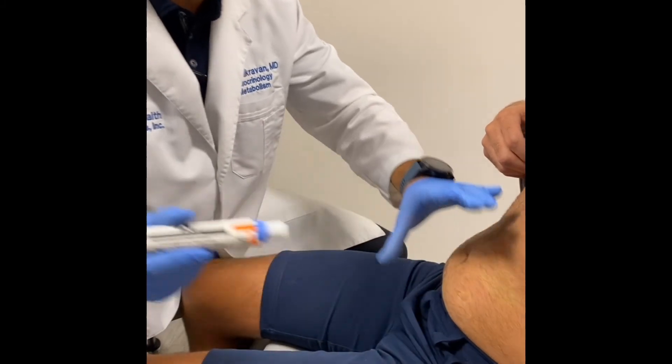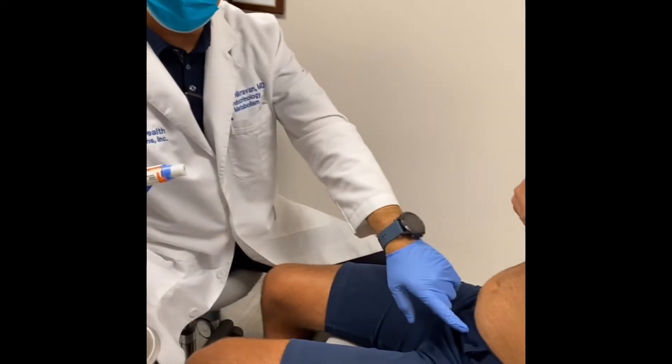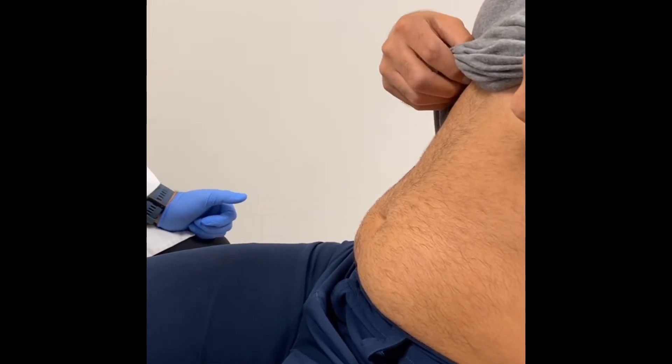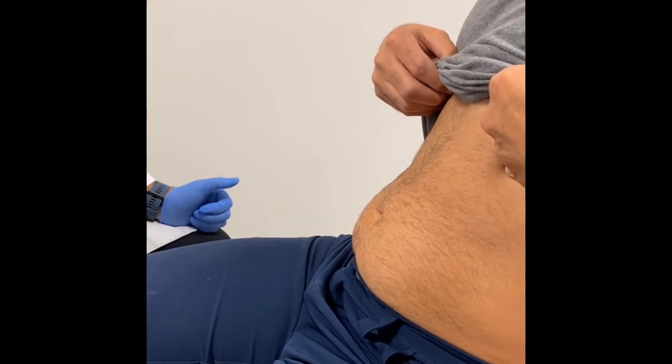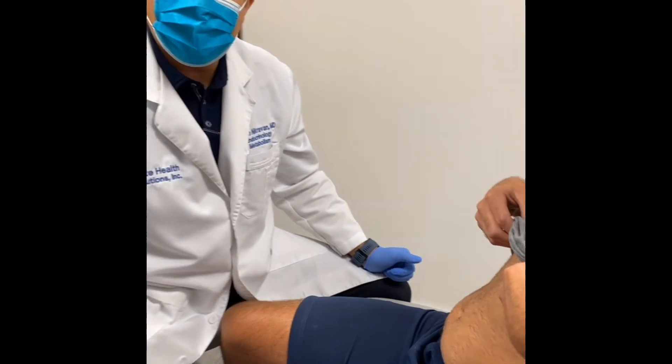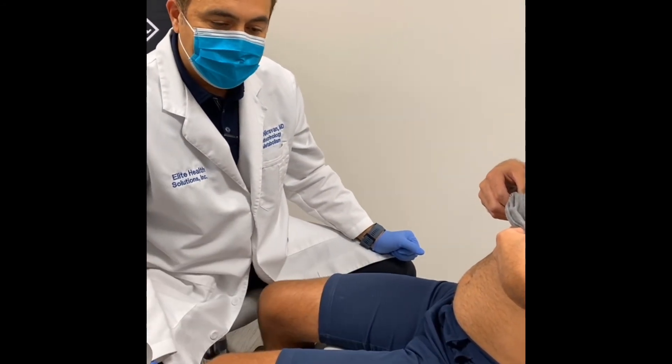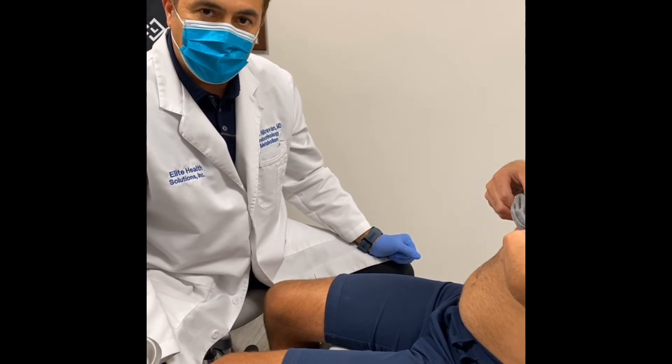Once you hear the click, you let go and that's it — testosterone was injected. Take a look at this site right here — you can see there's no bleeding, nothing whatsoever. It's very safe and effective. It's a once-a-week testosterone injection into subcutaneous fat. It works very effectively and the results are very impressive.